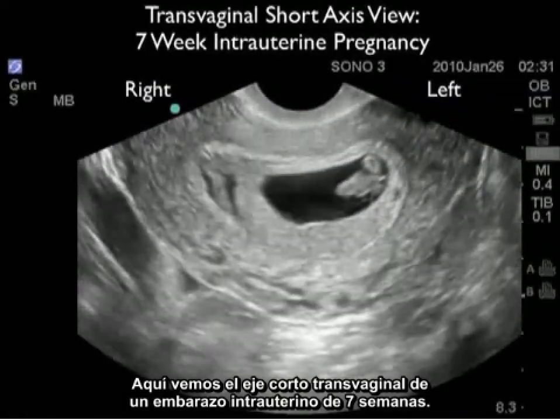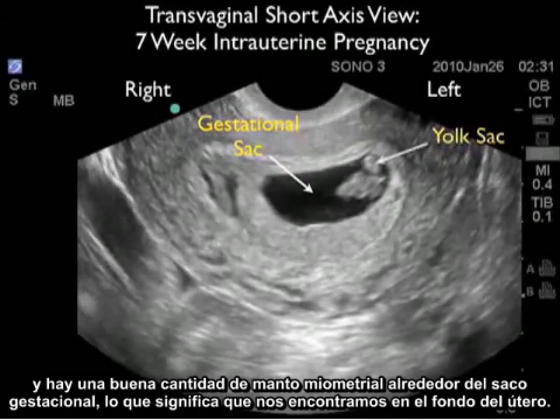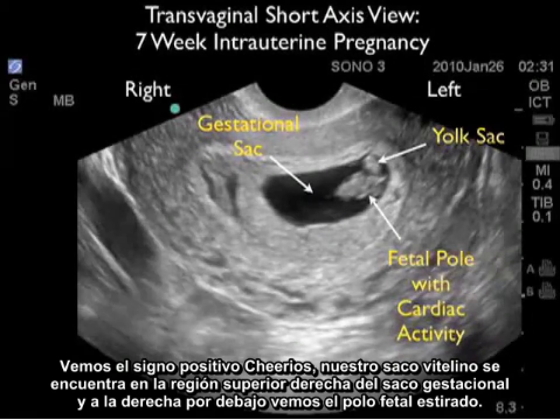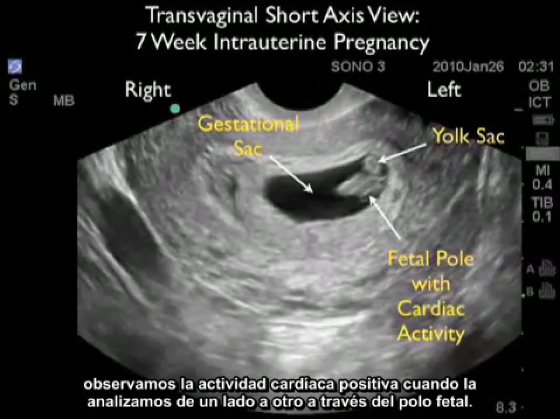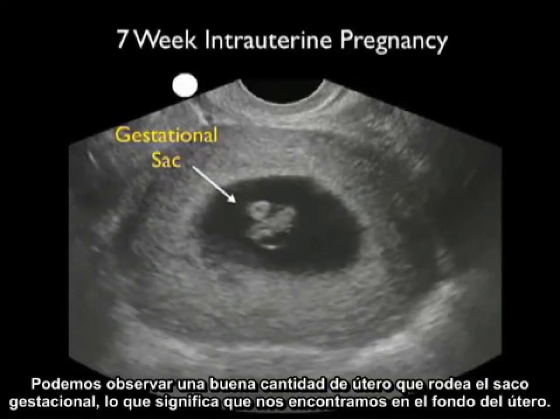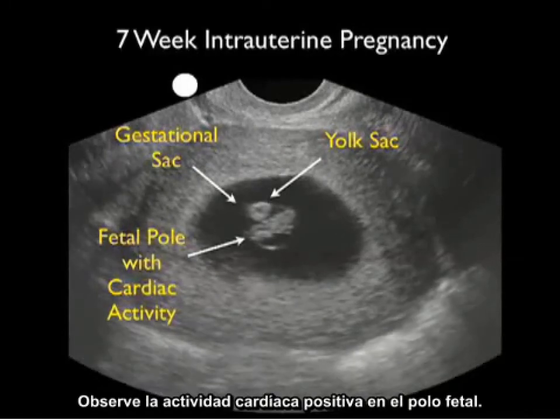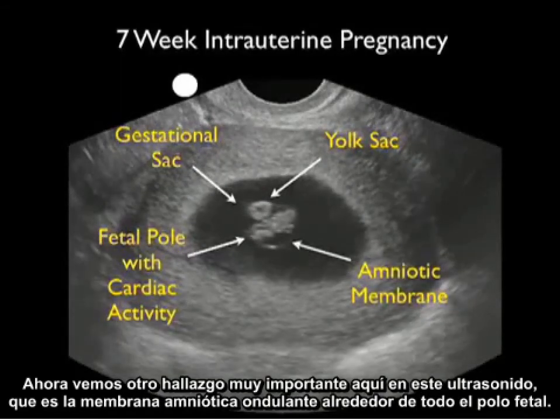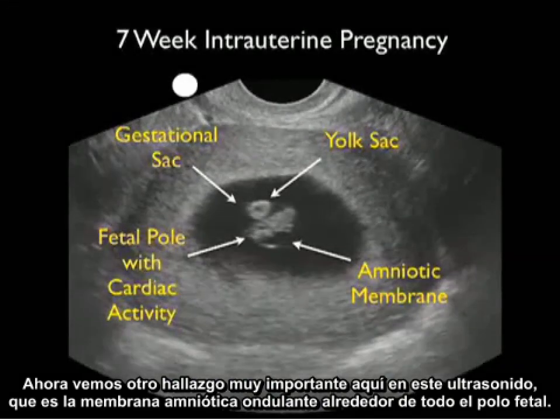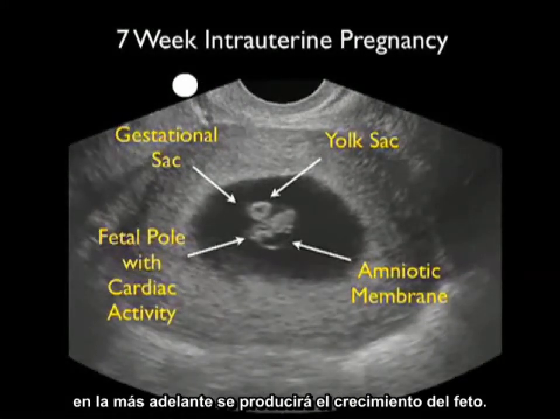Here's a transvaginal short axis view of a 7-week intrauterine pregnancy. The gestational sac is located in the center of the uterus, with a good amount of myometrial mantle surrounding it, signifying a fundal location. We see the positive cheerio sign or yolk sac to the upper right aspect of the gestational sac, and right below, the fetal pole stretched out with positive cardiac activity. In another 7-week example, the amniotic membrane is visible billowing out from around the fetal pole — it will eventually plaster down on the margins of the gestational sac to form the amniotic cavity for further fetal growth.